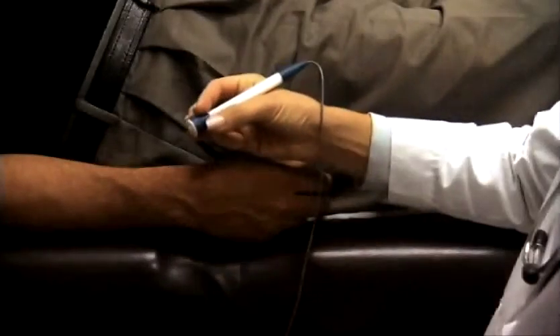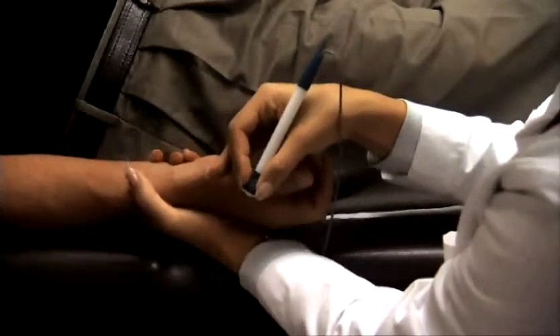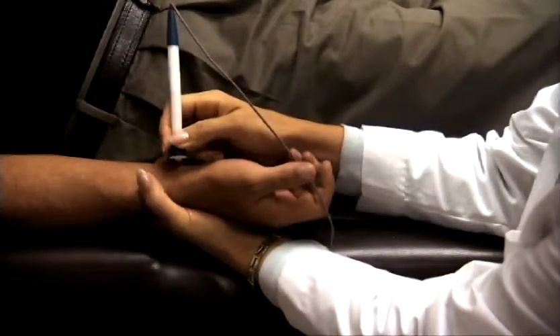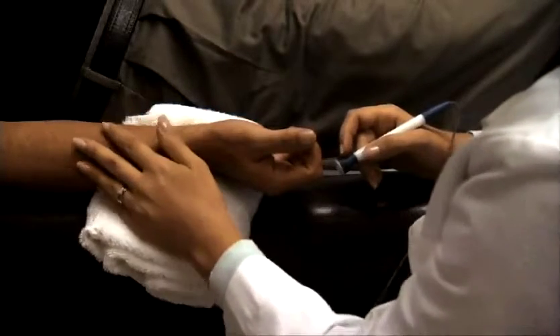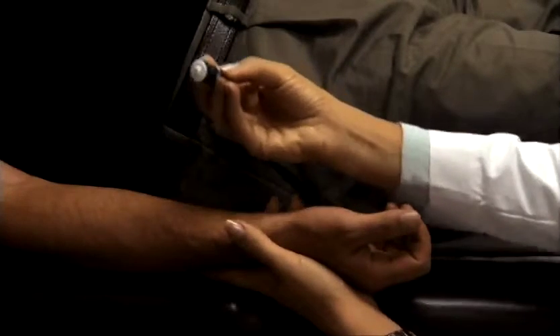freckle. Hold the tonometer in your dominant hand and use your other hand to support the patient's wrist, resting your arm on a stable surface. Allow a slight amount of backward flexion of the patient's wrist. You may use a small folded towel to promote this flexion, always making sure that the patient's arm and wrist are comfortable and not overflexed. Position the tonometer over the site of the strongest pulse point and prepare to take the measurement.